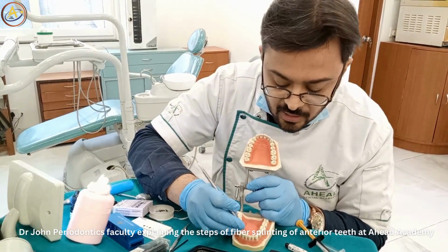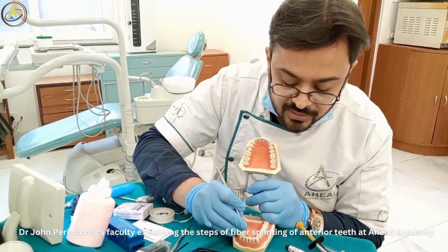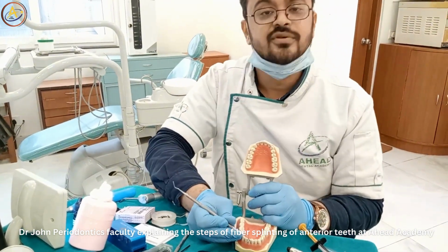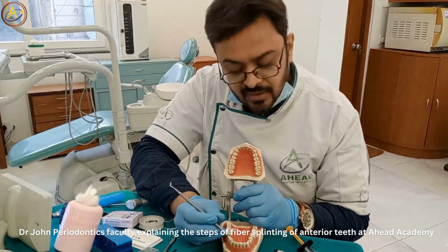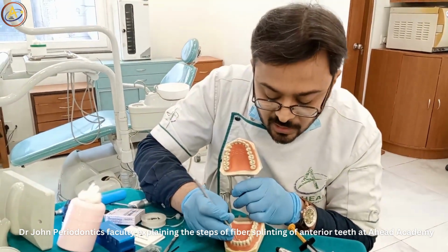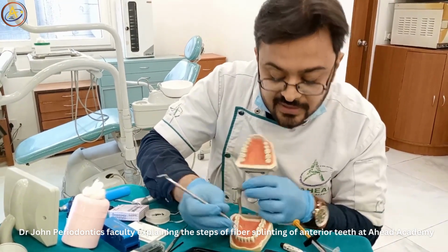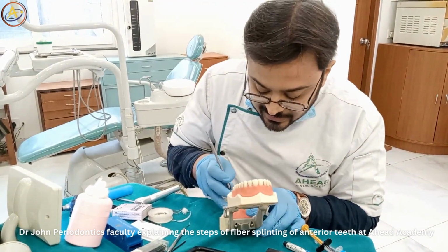Okay, you just apply it randomly as you think is fine. Okay, now what you have to do, remember always, composite has to be secured in all the areas, right? Example, this tooth is mobile, you are taking 3 and 4. So I am taking support from one lateral to the other lateral. Okay, so you have to trim this composite, apply it on all the areas in such a way that the patient should not feel anything extra on his teeth.